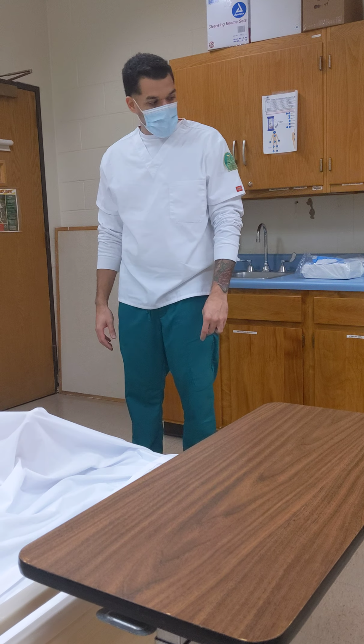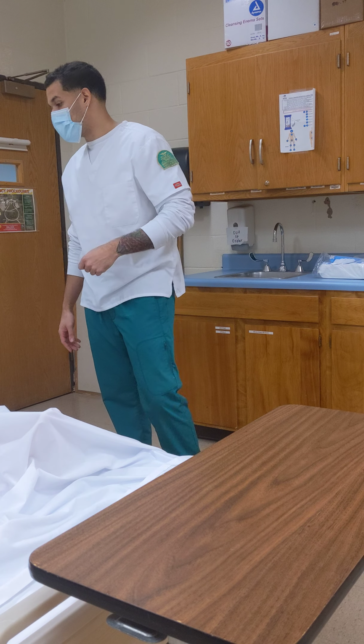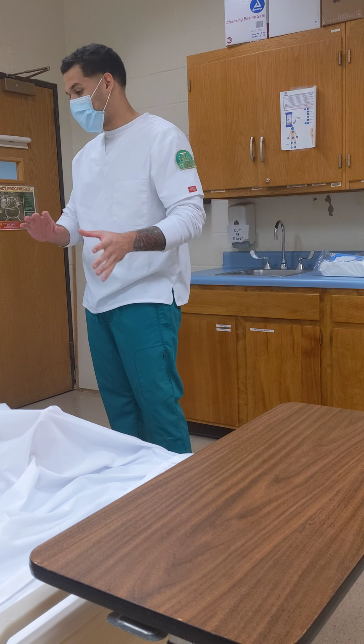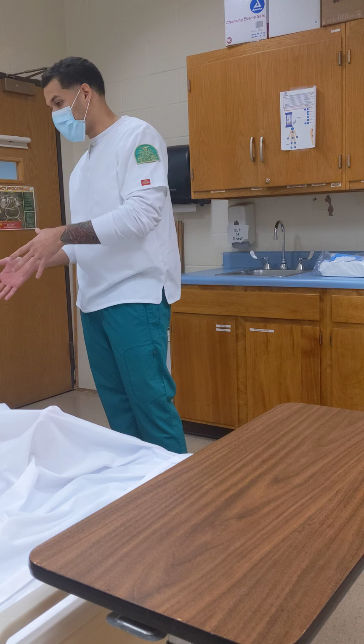Alright, so I'm going to be entering the room, providing patient privacy, introducing myself. My name is Joel Reyes. I'm a nursing student. Today I'm going to be applying a urinary catheter. Could you give me your name and date of birth?